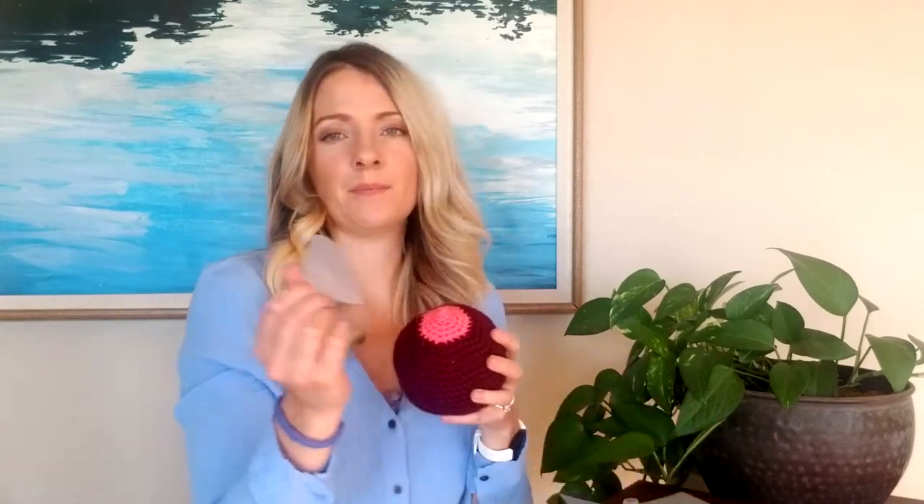Once baby gets used to using the Step 1 nipple shield, you'll introduce them to the Step 2 nipple shield in the same way. Then you can use the Step 3 nipple shield if you feel like you need to. Many moms by then feel their baby is used enough to their regular nipple and don't need Step 3, but some moms do go all the way through all the steps and have had success that way.